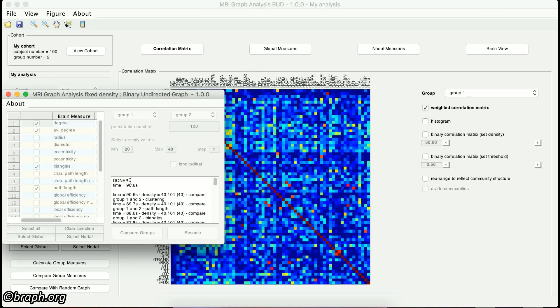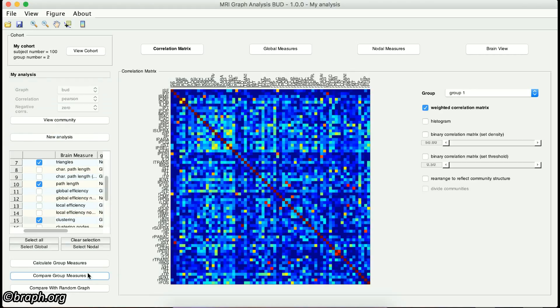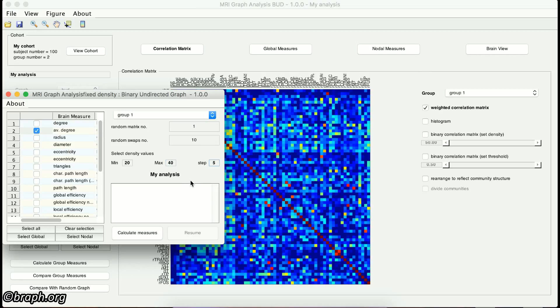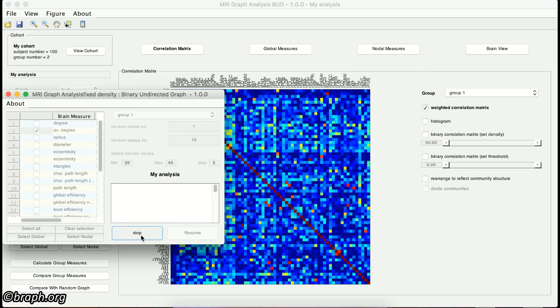In the case that you want to compare a group of subjects with random graphs, click on the Compare with Random Graphs button. Again, select the desired measures and the group for which you want to calculate the measures. In the box in front of the random matrix number, enter the number of random graphs you want to use for comparison, and for the random swap number, enter the number of edges rewiring for the randomization. Then define the density interval and the step size, and finally start your comparison.